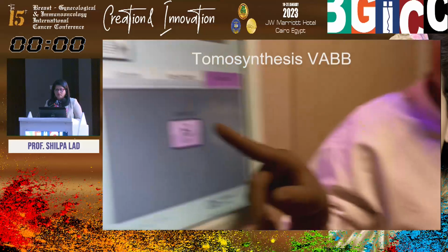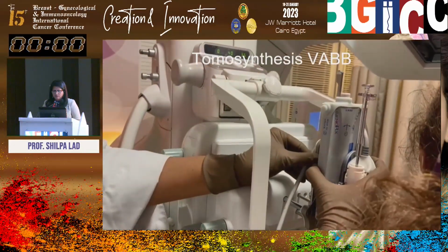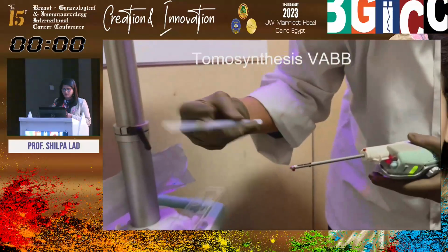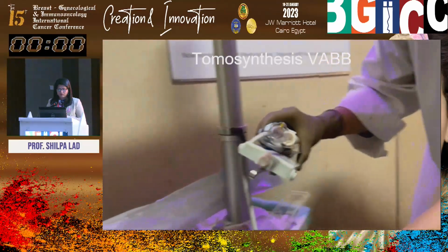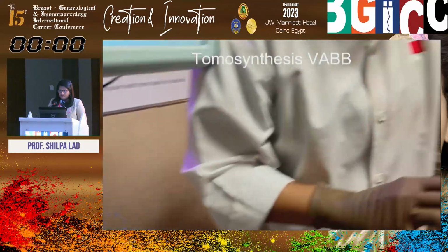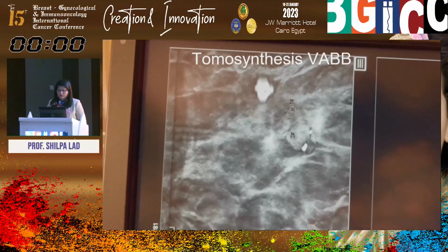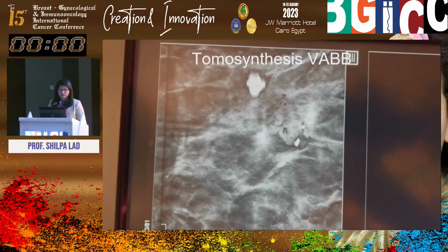And then once this is done, we're going to unengage the entire assembly here, okay, and just put the little cover back. This is a safety cover, so do not discard it. And the last step of this particular procedure is to make sure that the marker clip has got deployed. That's our little fiducial marker clip, and it's in a good spot within the cavity. Okay, so this is all successful, done.